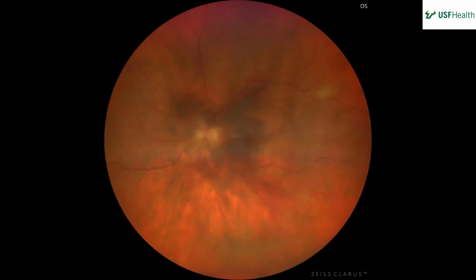Okay, and so then this is a color fundus photo of the left eye. Very obvious, hazy media. You can't really make out... It just seems mostly like it's the media that's causing the obscuration of the retina. I can't really tell beyond that where the pathology lies. You see a blurry nerve. You can see centrally it's more blurred around the peripapillary area, whereas you do get a little bit more definition to the vessels as you extend out to the periphery.